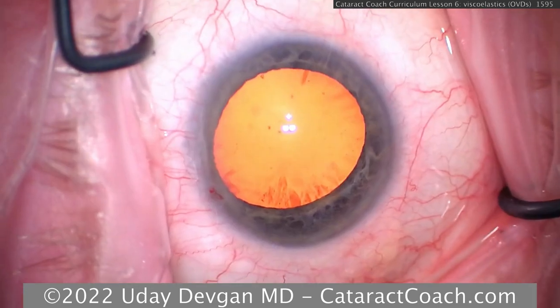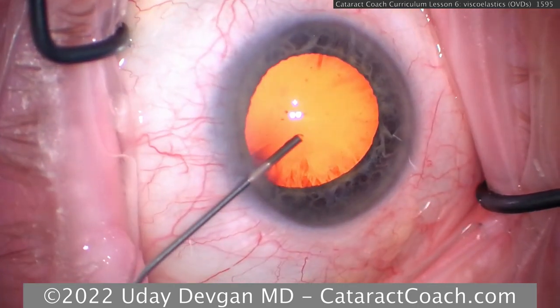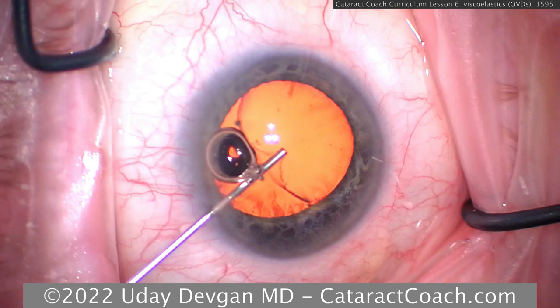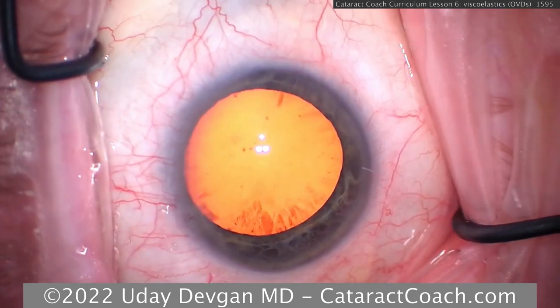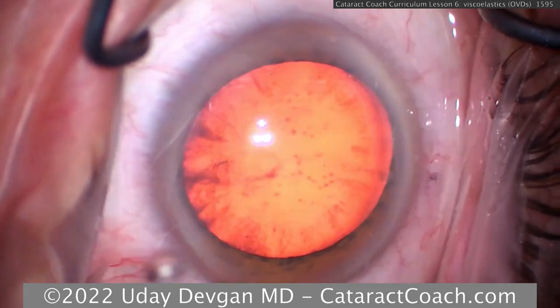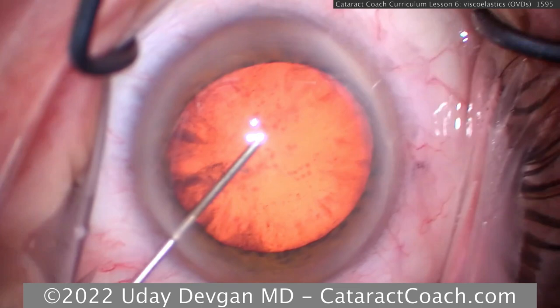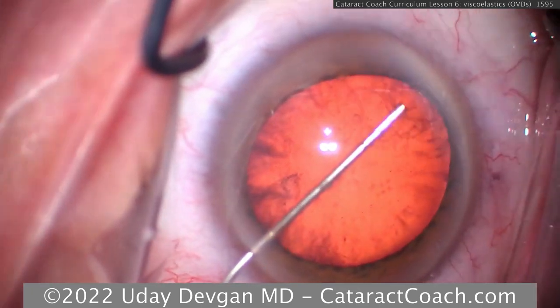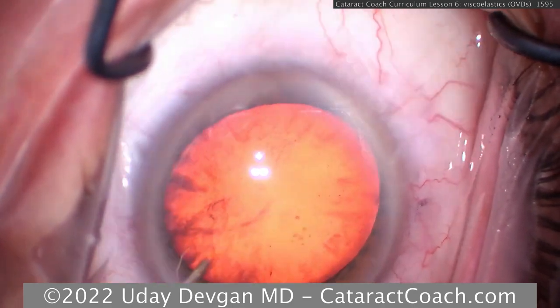Once we have that viscoelastic wave, we're sure that it's going to completely coat the corneal endothelium, and it'll stay in position even when we use high flow during cataract surgery. Finally, here's one more case. We'll come across the eye again, and we're going to slowly make sure we don't deflate the anterior chamber, and then with a forceful push, we get a wave of viscoelastic. So make sure when you use this dispersive, get a wave.